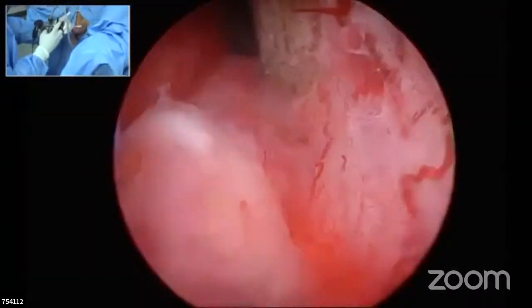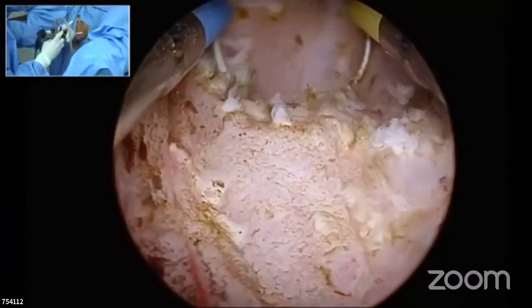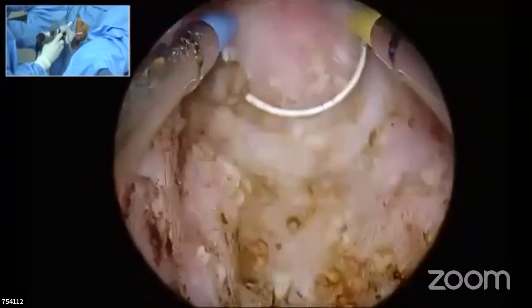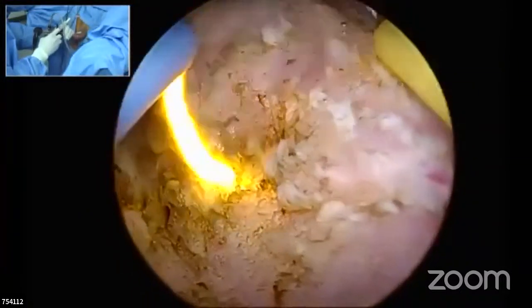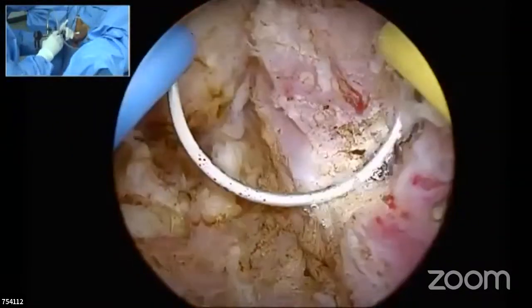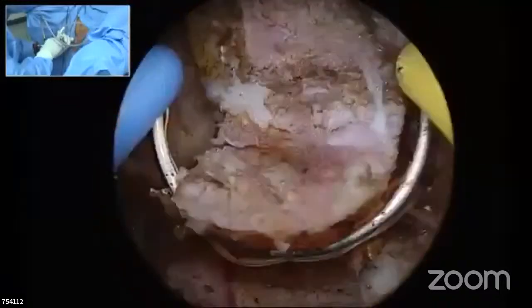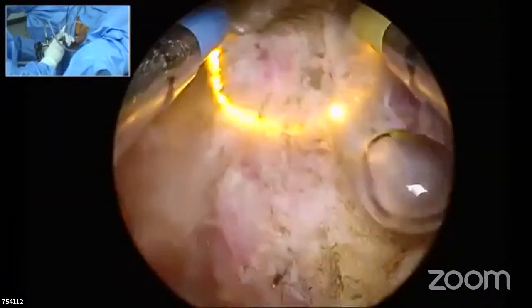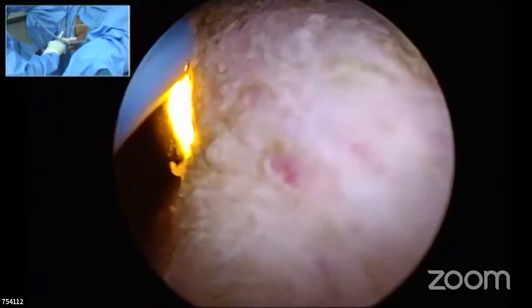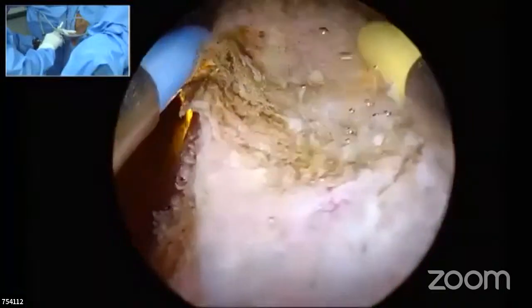And the second point which is being asked was what is the difference between monopolar and bipolar? If you see this, in a bipolar, you activate the loop and cut the tissue. Whereas in a monopolar, you tag the tissue and start cutting the tissue. That is the difference. You see, in a monopolar, there is some amount of physical energy by the loop which will be involved during the cutting of the tissue. Whereas in a bipolar, it is not needed. What you require is a corona which is already created, which will cut through the tissue, and the loop will move through the tissue as if it is moving through butter. So that is the difference between monopolar and bipolar.